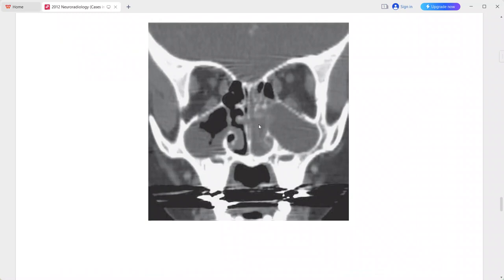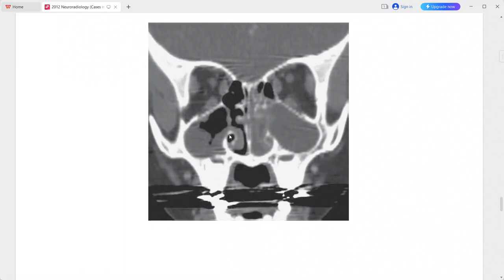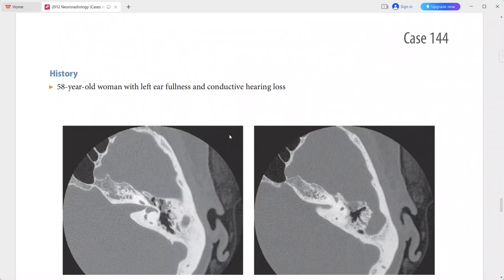The lobular mass is extending into the nasal cavity and nasopharynx and is also causing widening of the sinus ostium. However, no bone destruction is evident. This is a case of antrochoanal polyp. Differentials include inverting papilloma, mucocele, allergic fungal sinusitis, and sinonasal neoplasms.